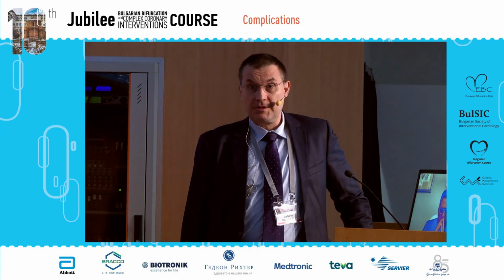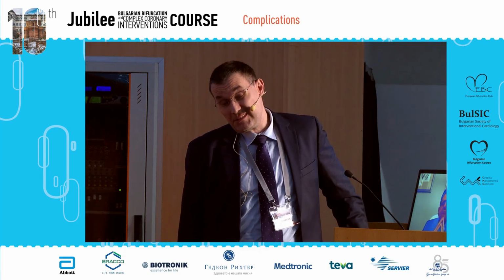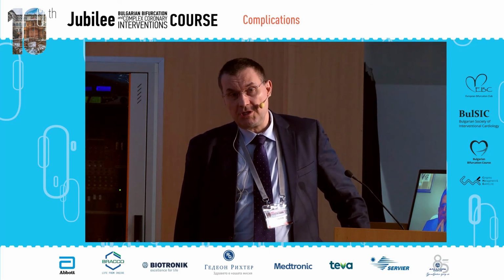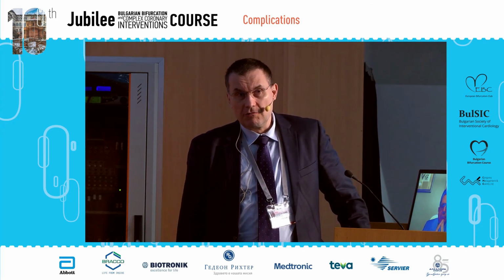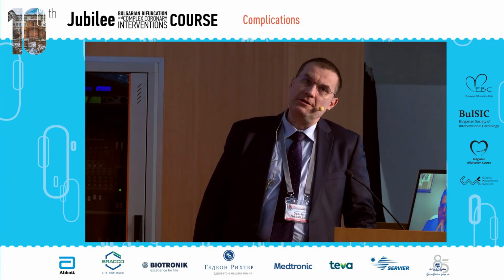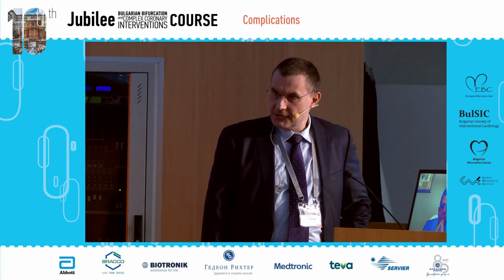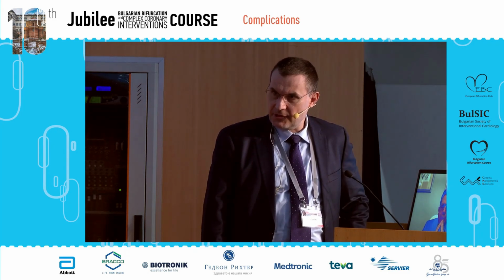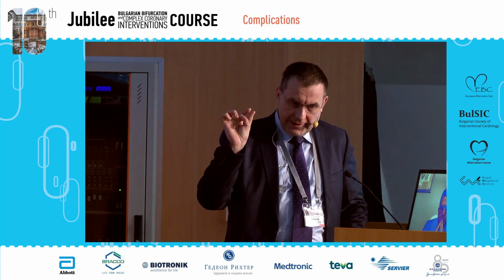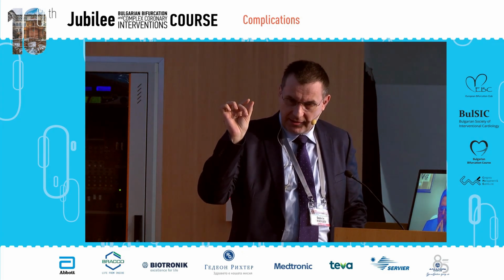We are preparing a paper now about this technique. We made several bench testings, and the problem with positioning with the POCI technique is escaped totally, just because you orient yourself by the markers of the balloons. You place first the proximal marker of the side branch balloon exactly at the edge of the stent.